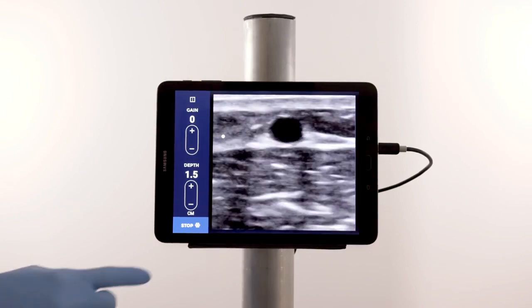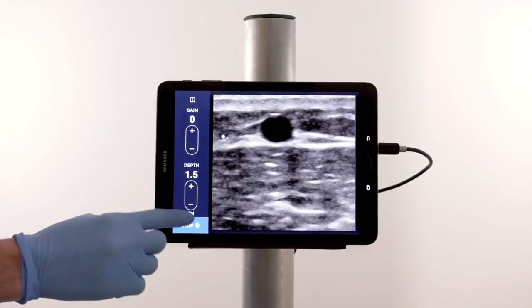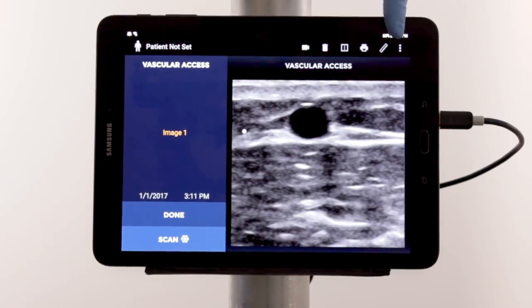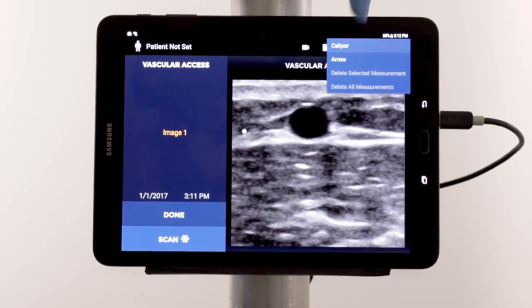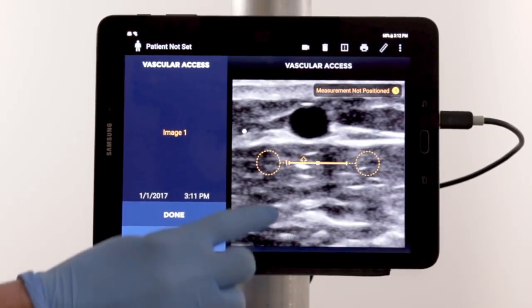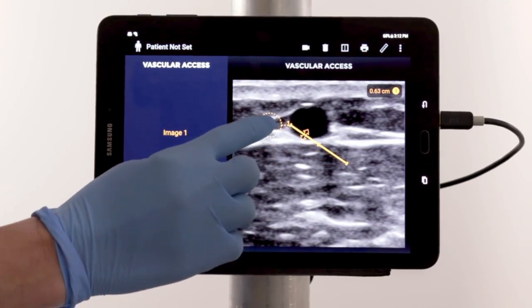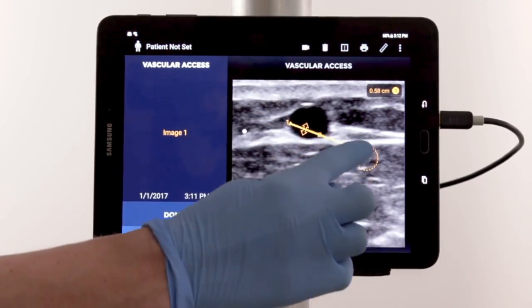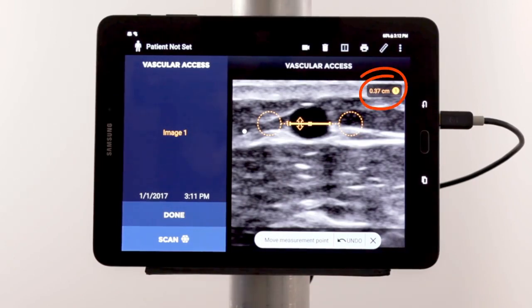To measure the vessel, tap Stop, then the Caliber icon, then the word Caliper. The Caliper tool will appear on the screen. Move the measurement point to one side of the vessel, then move the second measurement point to the other side and note the diameter.